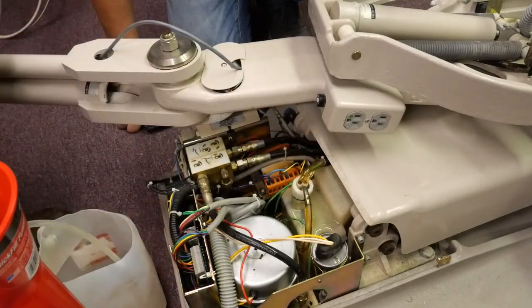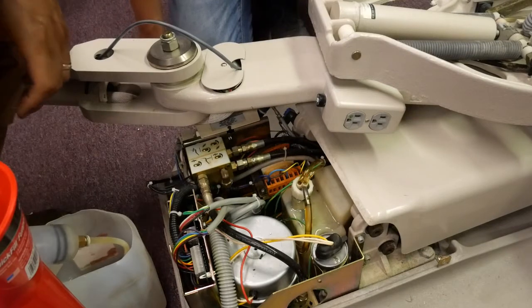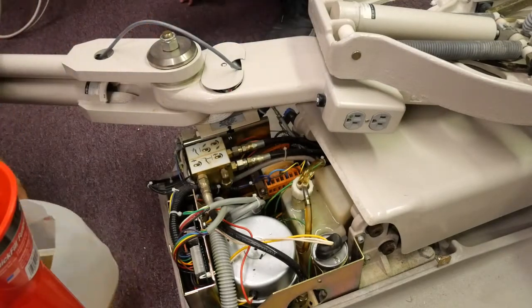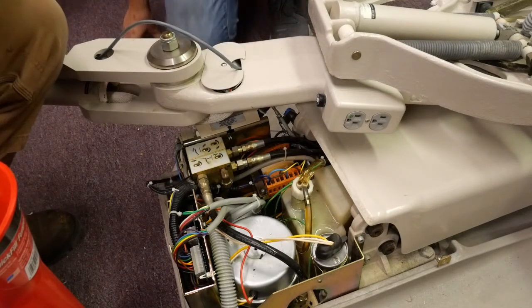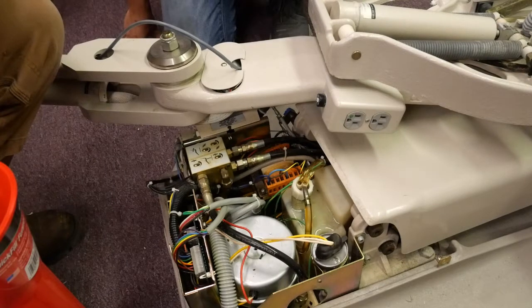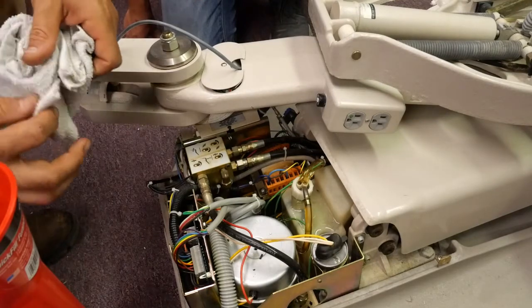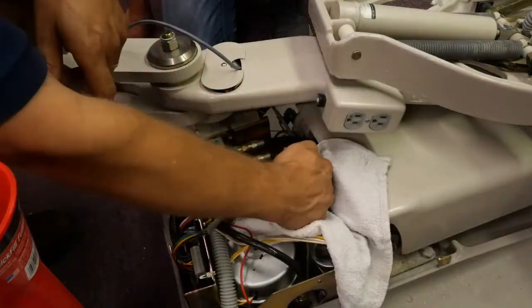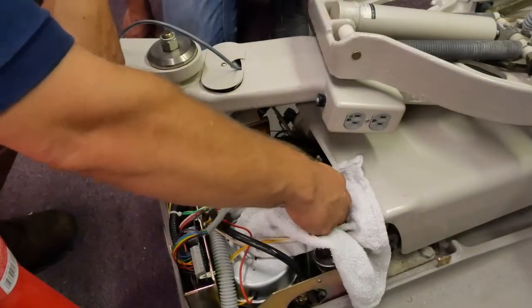So this is how you would remove oil from the chair. And now we made a little bit of a mess. So the way you clean that up is by using some rags. All right, we'll just take those rags, push them in there, kind of sop up some of that oil.